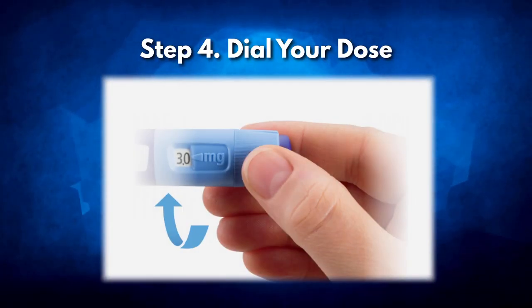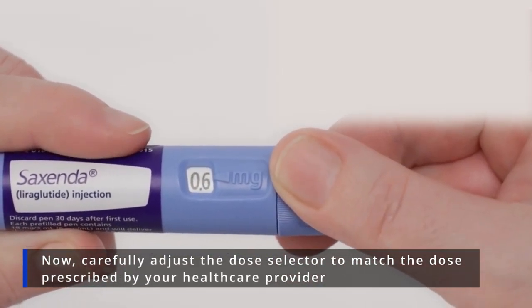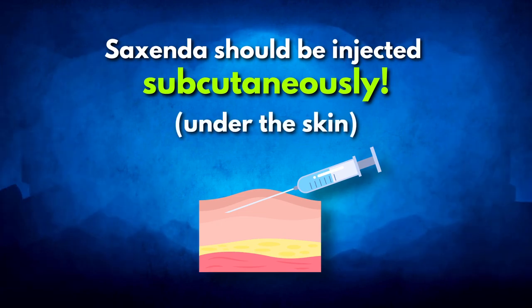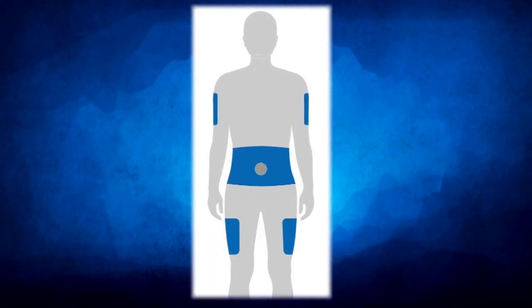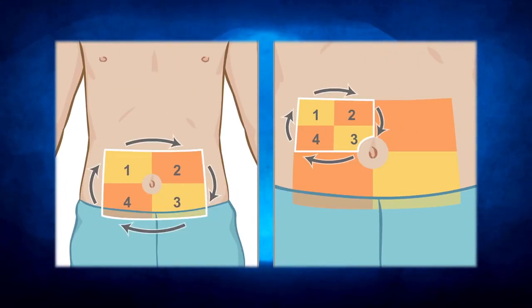Step 4: Dial your dose. Carefully adjust the dose selector to match the dose prescribed by your healthcare provider. Step 5: Choose your injection site. Remember, Saxenda should be injected subcutaneously, which means just under the skin. The recommended sites include the upper arm, abdomen, or thigh. Rotating the injection site is crucial for minimising skin complications.